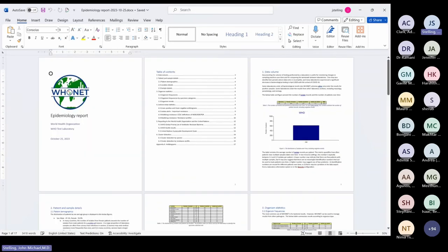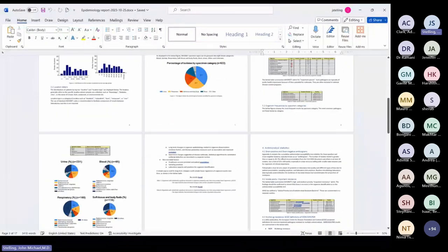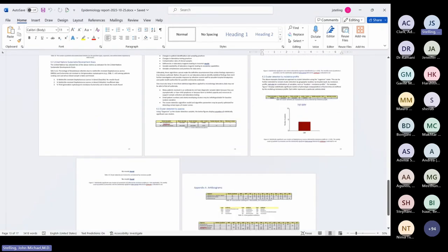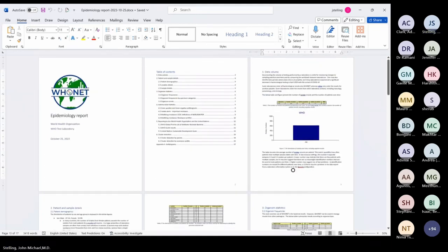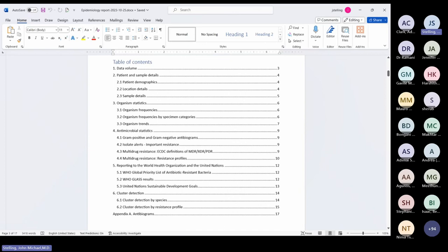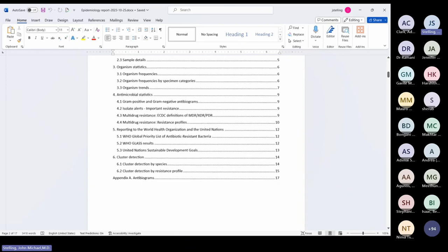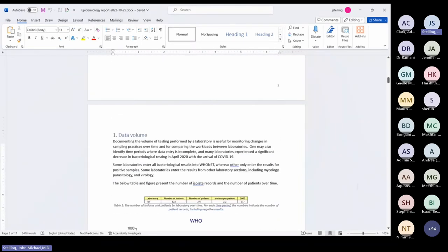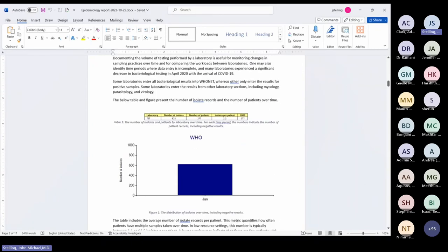First I'll zoom out so you can see the detail. There's a lot of detail, graphs, and text in this document — it says page 13 of 17, so this is a 17-page document with a variety of outputs. Zooming in: this was created today, there's a table of contents, data volume, patient and sample details, organism details, antibiotic details, number five — reporting to WHO and the UN Sustainable Development Goals — cluster detection, and antibiograms. The text describes what you were looking for. This document is educational and useful for sharing with colleagues.